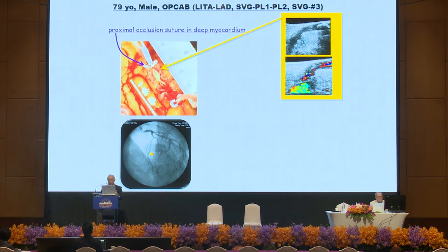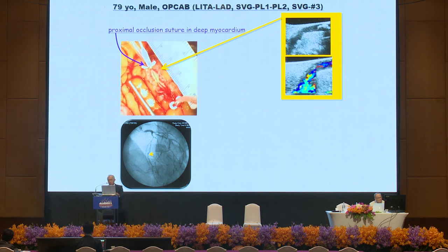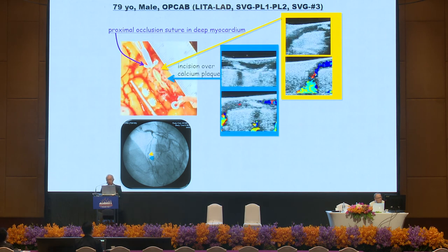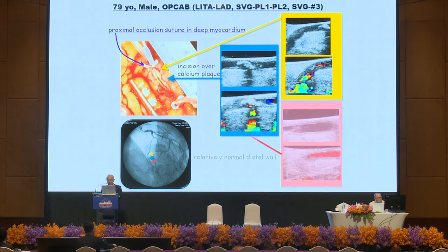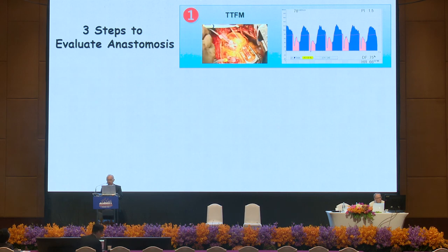This is a real picture during the operation. You can compare the real picture and the ultrasonic pictures. So definitely, in the center of the incision there is a calcium plaque, and the distal part is okay. So I did a long onlay patch plasty.